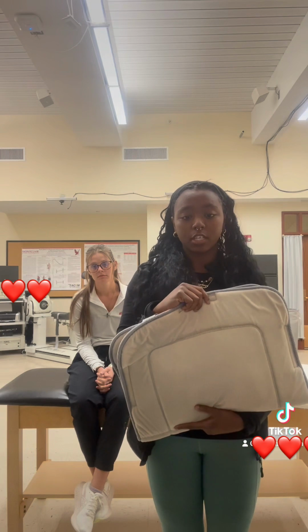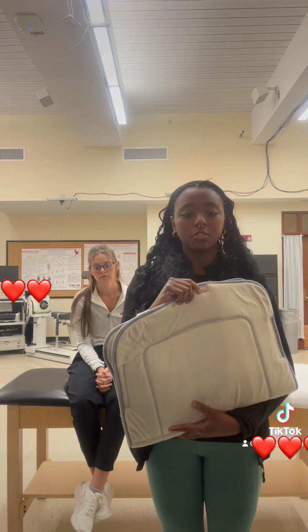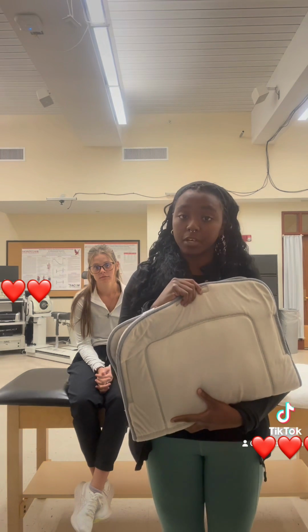Today I'll be demonstrating the use of a heating pad, which is a superficial heat modality. It works through conduction, which means heat transfers directly from the pad onto the skin and tissues. The effects of using superficial heat are that it increases blood flow, decreases muscle spasm, increases tissue flexibility, and aids in pain reduction.